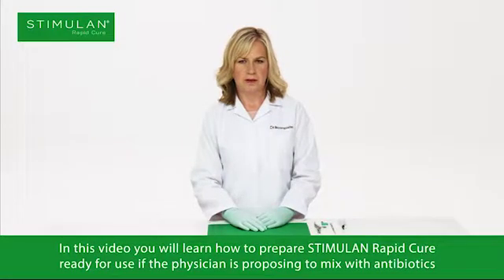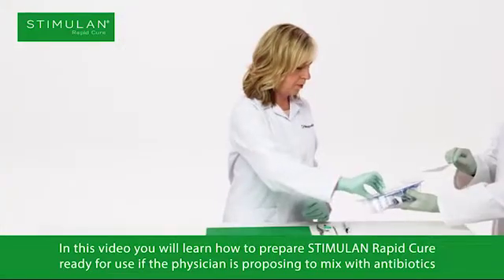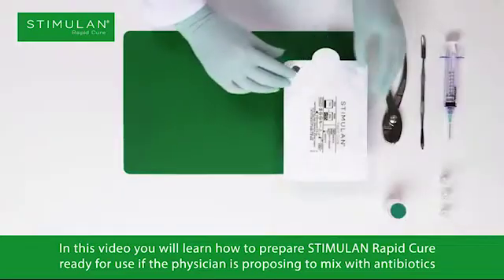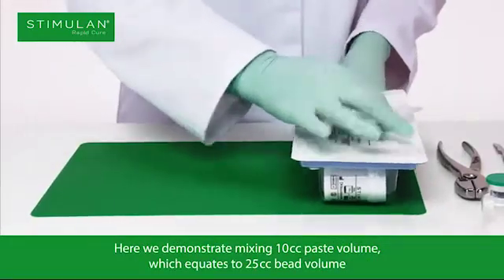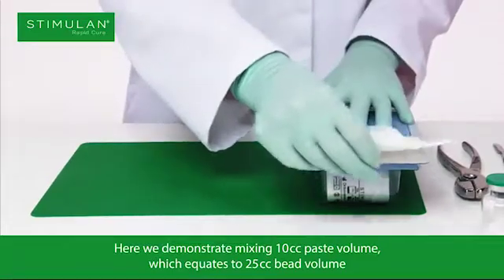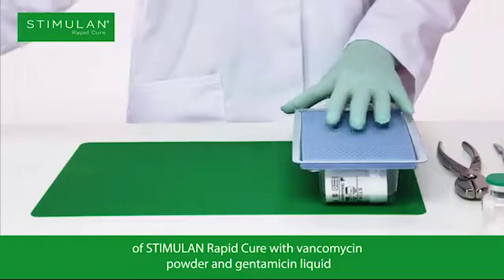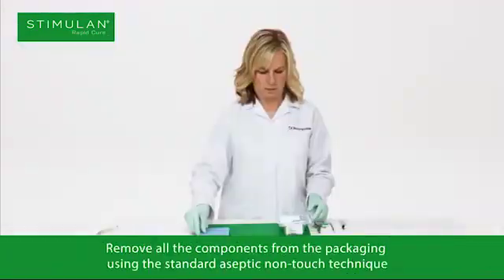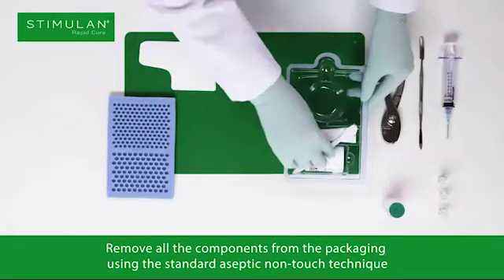In this video you will learn how to prepare Stimulan Rapid Cure ready for use, if the physician is proposing to mix with antibiotics. Here we demonstrate mixing 10cc paste volume, which equates to 25cc bead volume of Stimulan Rapid Cure with vancomycin powder and gentamicin liquid. Remove all the components from the packaging using the standard aseptic non-touch technique.